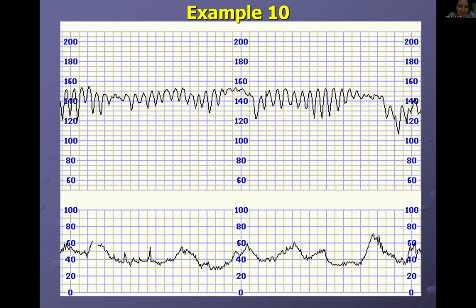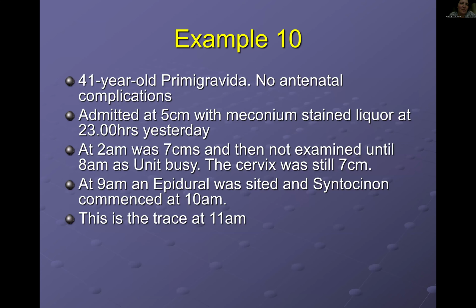So just at a glance, does this look good or not? Well, this looks very bad. Exactly. This is the typical sinusoidal pattern, which I hope you never get to see in your life. You never want to end up in a situation like this, where she was obviously mismanaged, all right? She was heavily mismanaged, meconium stained, and then left for all that time without being examined.